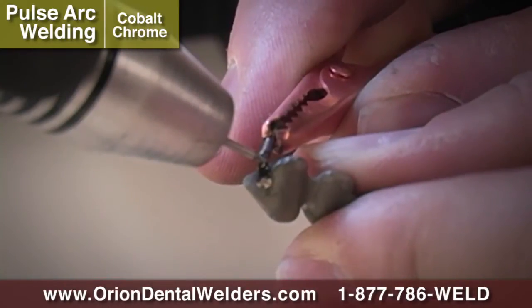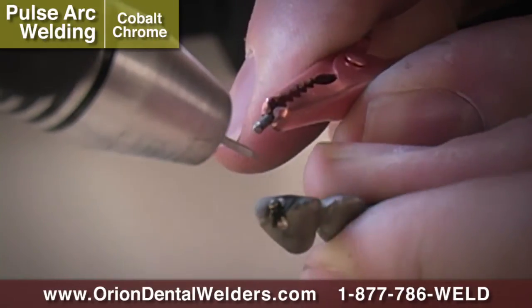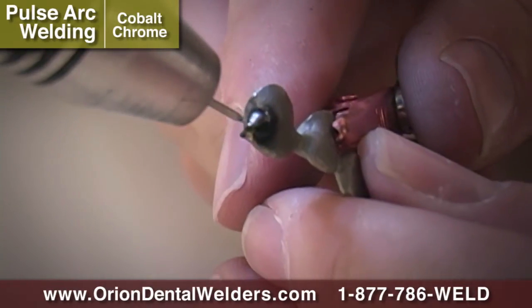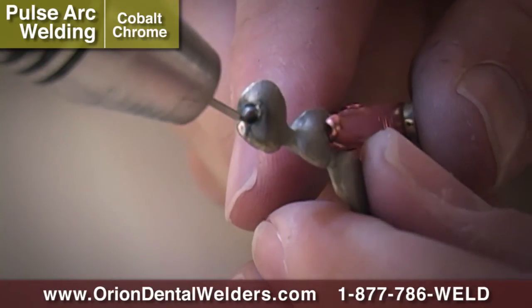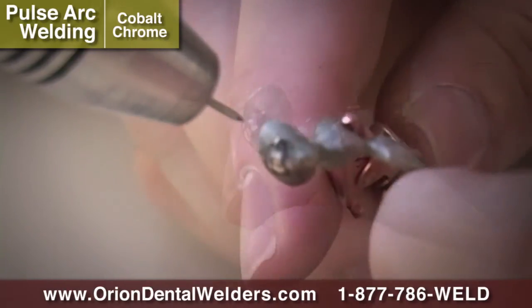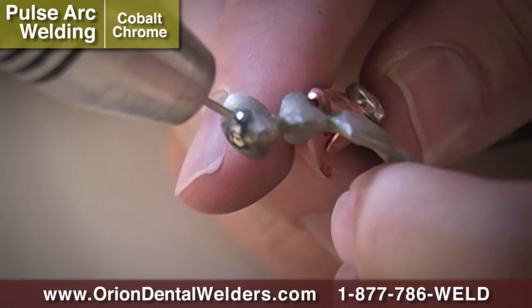By placing tension on the sprue, a weld can be used to sever the excess material. The High Power Pulse Arc Mode can be used to help smooth the excess material. If less heat is desired, use the Micro Pulse Arc Mode to finish the smoothing process.